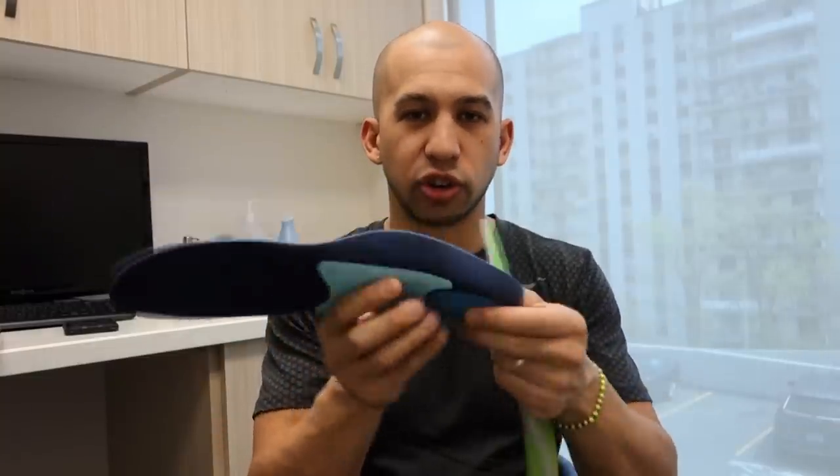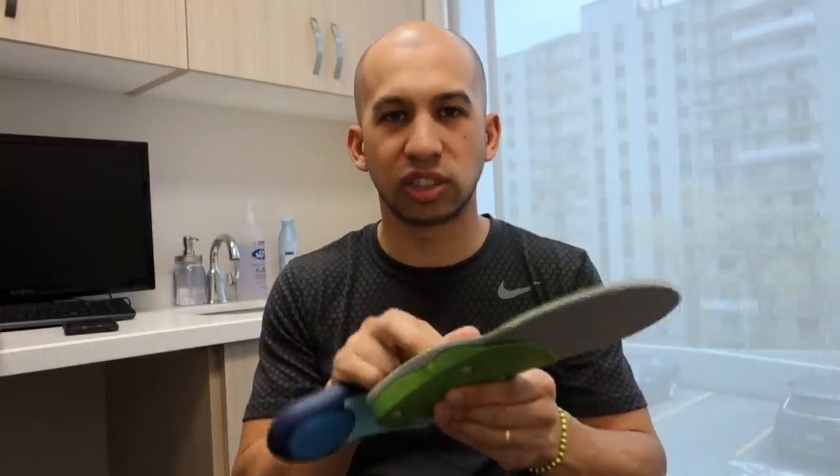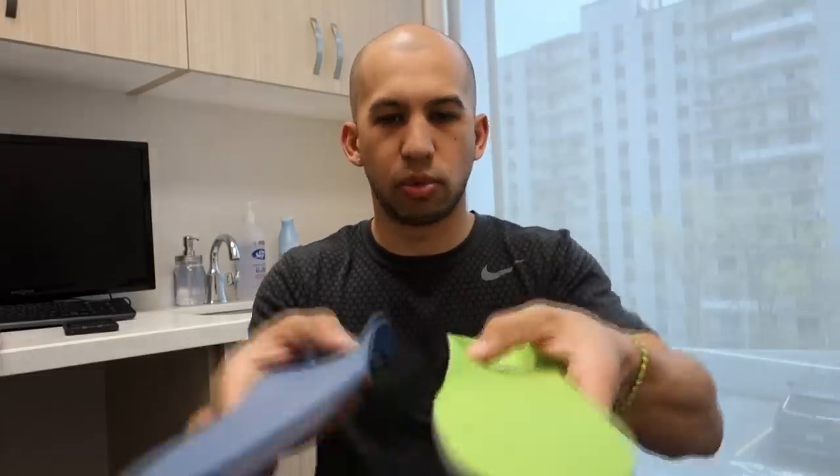The Dr. Scholl's one is a lot softer with a lot more padding, while this one is much firmer. So even though we get support, we lose some of the cushioning factor — it really depends on what you need. Personally I like the comfort aspect, something that's really soft but also has support.